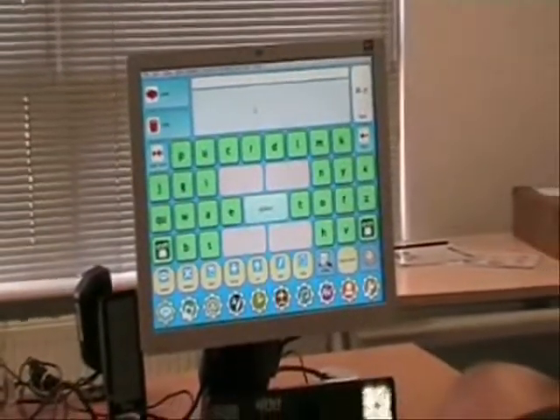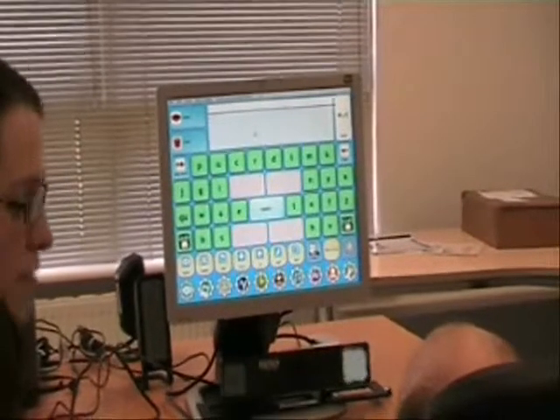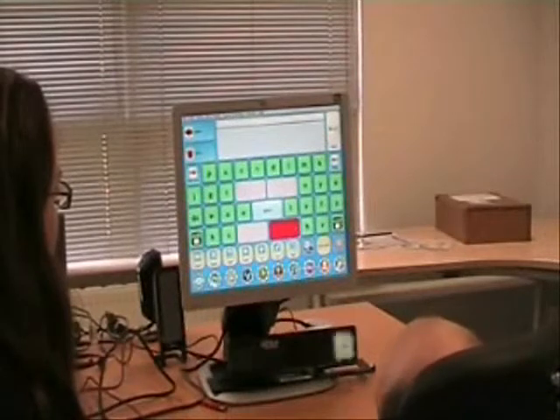I'm going to ask you a simple question just to get used to the keyboard. Can you tell me your favourite television show? Well done, well done.